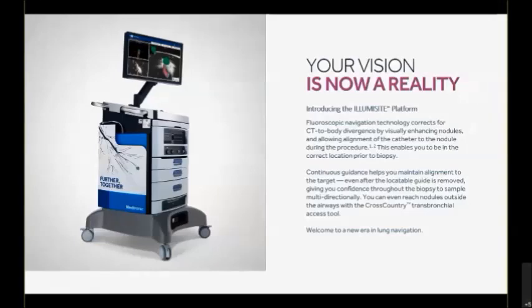The first couple slides are actually going to be prepared by Medtronic, which I appreciate. This is the new device, a new tool called the Illumisite. It's the standard superDimension, but they've added fluoroscopic navigational technology, so we're able to correct for CT-to-body divergence. They also added a continuous guidance tool, which means that once you get to the target and correct it with local registration with fluoroscopic navigation, you redirect to the target after it's been corrected. And when you take the LG out, you continue to have a navigational tool. Next slide.